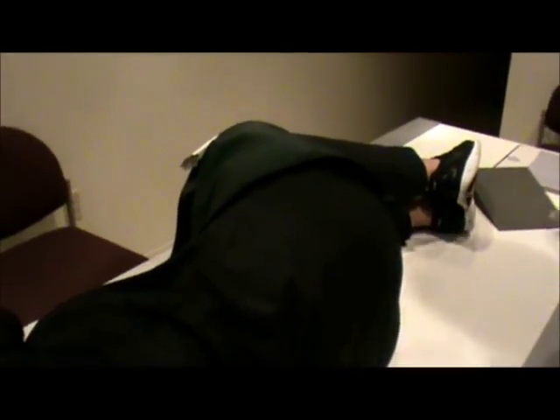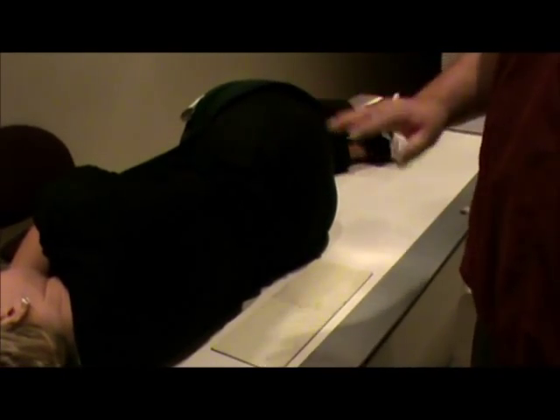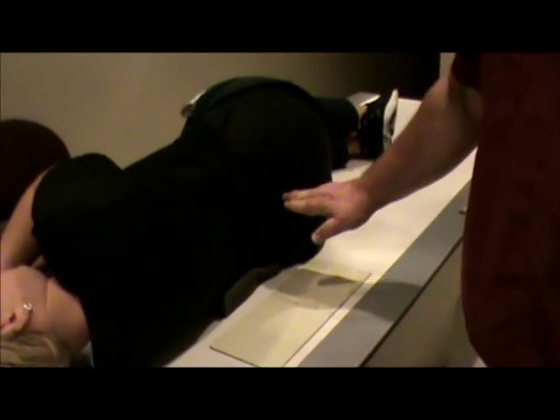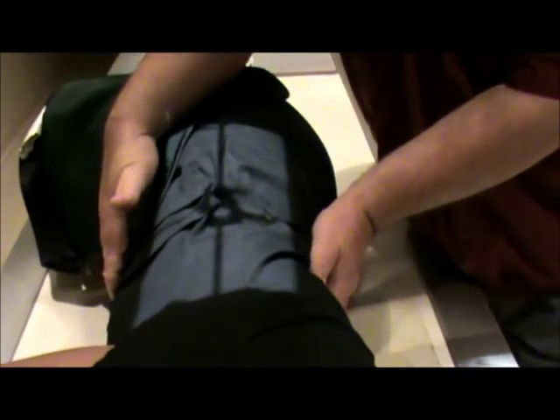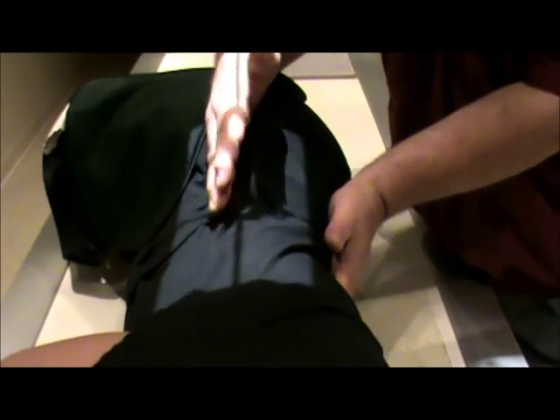Because of the curvature of the spine — as you look at the spine, it sort of curves down into the sacrum at the bottom — we're actually going to put a sponge underneath the patient. That actually helps to straighten the spine for us. Our centering is going to be palpating the crest again. We're going to go about one and a half inches up, and then centering side to side, I'm going to palpate both posterior and anterior, find the MCP, and go to the center of that point.